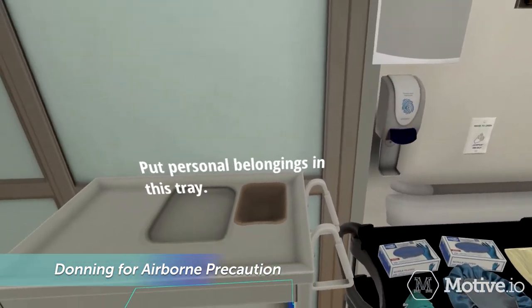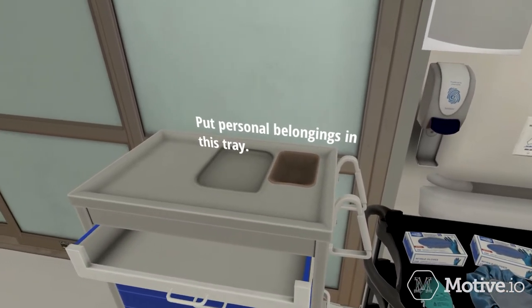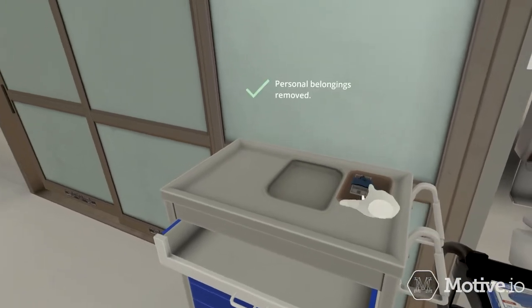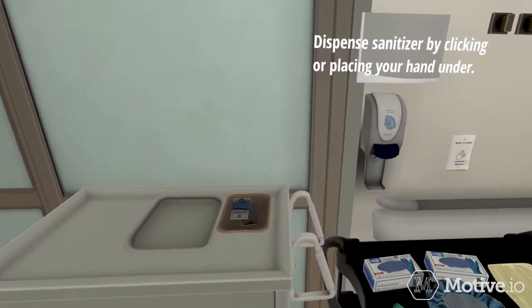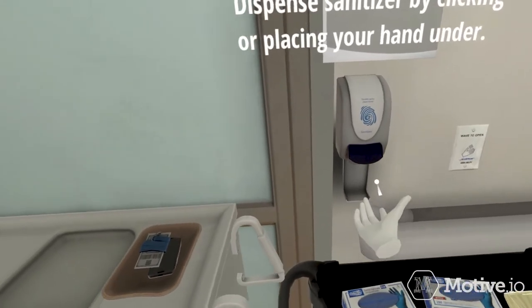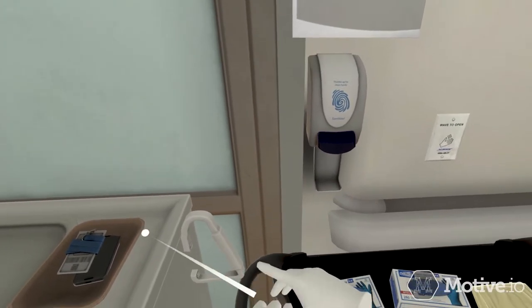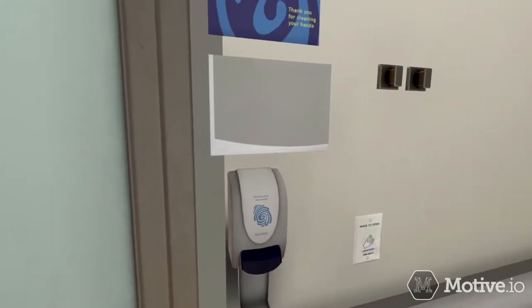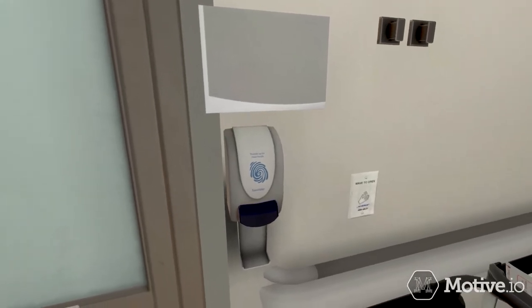Always begin by removing all of your personal belongings and making sure that your hair is tied back. Touch or click the tray to place your personal belongings. Perform hand hygiene using an alcohol-based sanitizer. Clean all surfaces of hands and wrists for at least 20 seconds, and allow your hands to dry before moving to the next step.